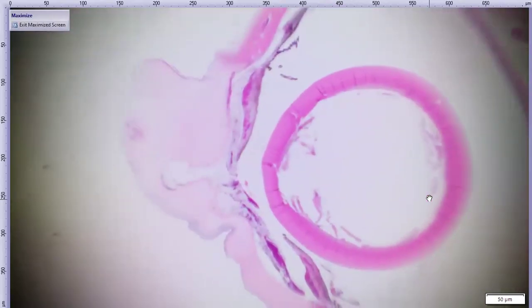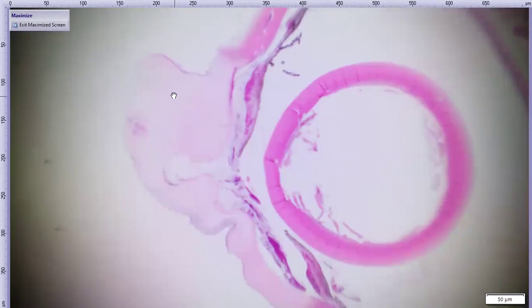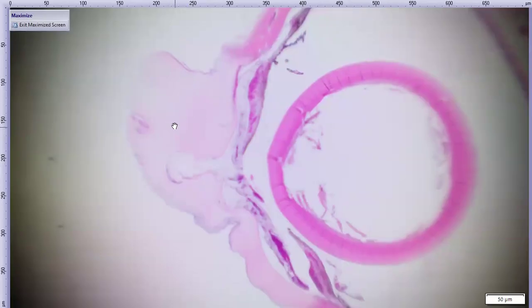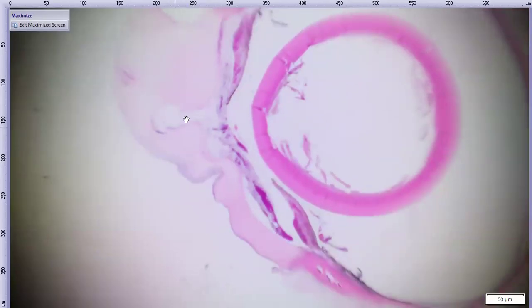Okay, so cornea to the left there. And that's where we're going to spend all our time on this case, is the cornea, because the rest of the eye is pretty normal. So we do have true ulcer in this case, I promise. The corneal epithelium is absent from the surface of this cornea. There is a little bit of basophilia here, so there are some islands of corneal epithelium remaining. And the corneal stroma is very pale in the center there.